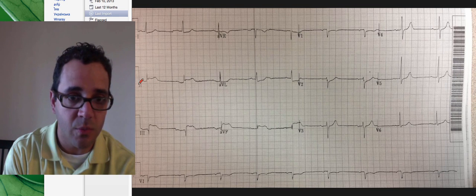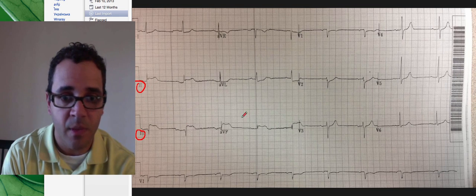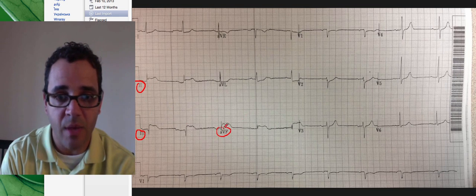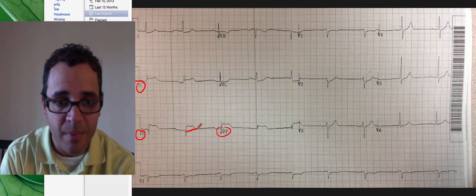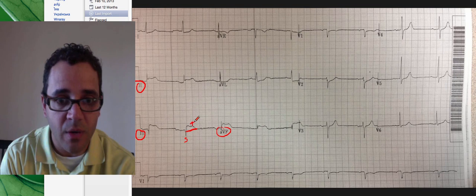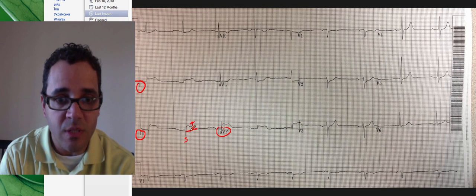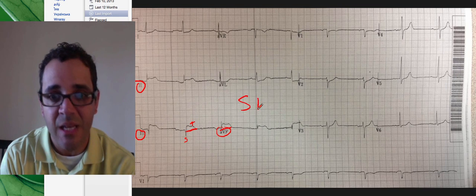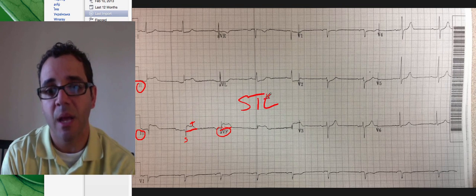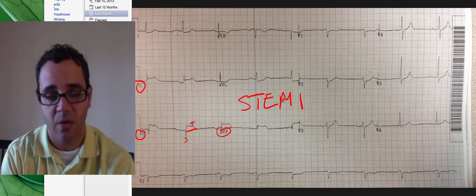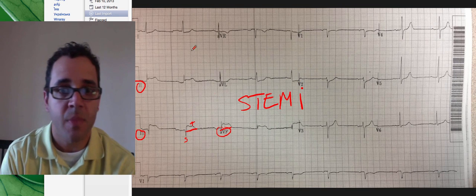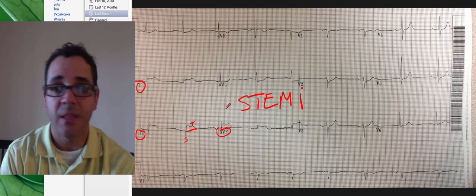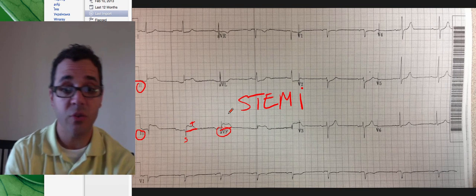Inferior leads are number two, number three, and AVF, and you can see right here those ST segments. So this is the S and the T over here, and you can see how elevated they are. This is an ST segment elevation heart attack, or MI, or a STEMI, and this was just a couple minutes after that first EKG which was non-diagnostic.